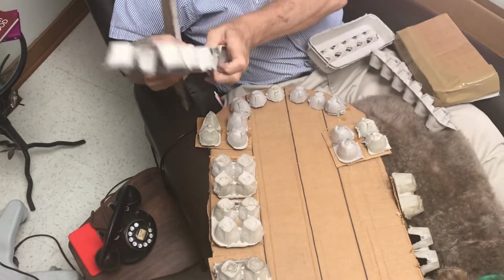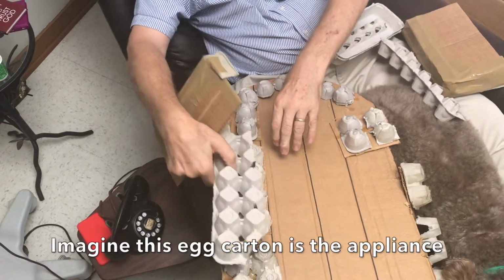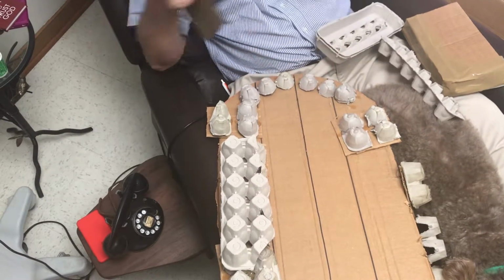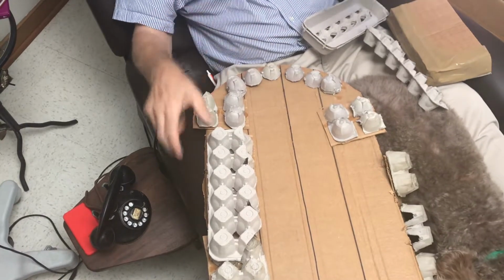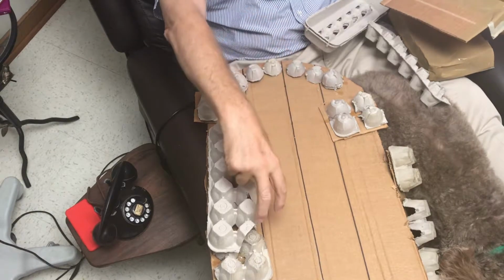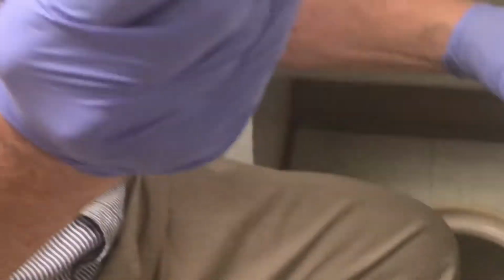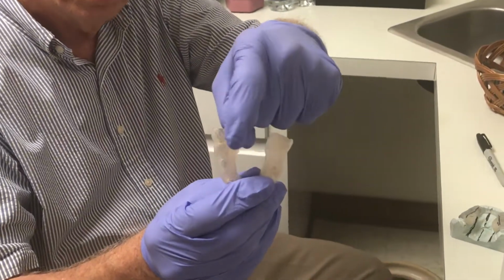So what we've done is created a place so that when the tongue comes in, it hits on the back and then comes up through this shape that we have created, so that instead of being all on the line, some of it, when the tongue comes in, it's hitting the bulk on the left, and then it comes over to the other side where there's another place that's shaped, and it forces the tongue farther forward and up onto the teeth.